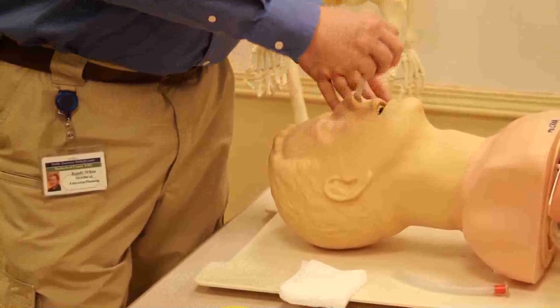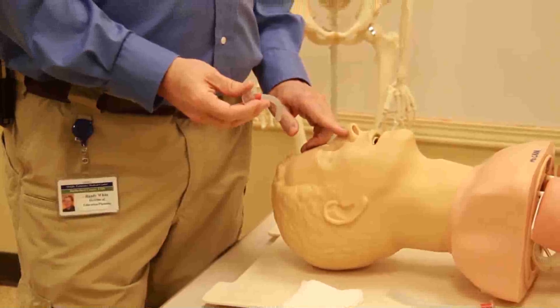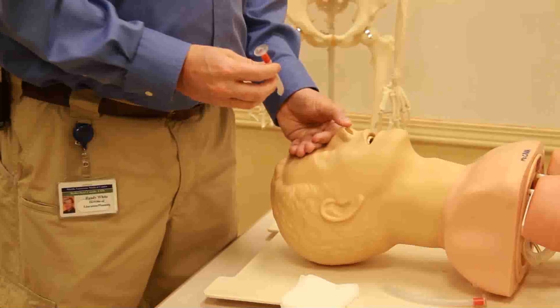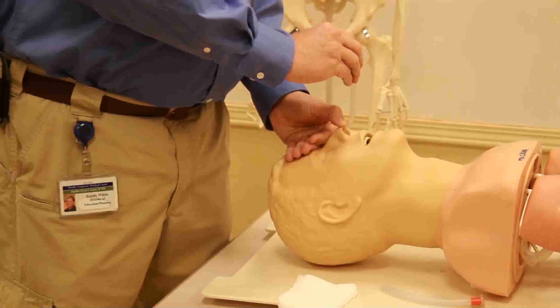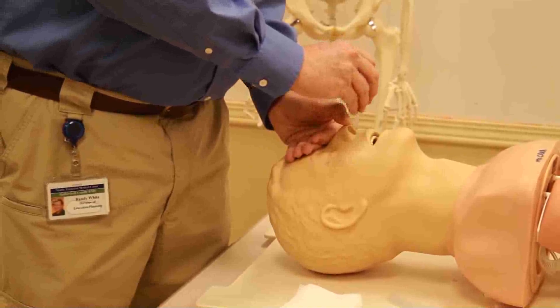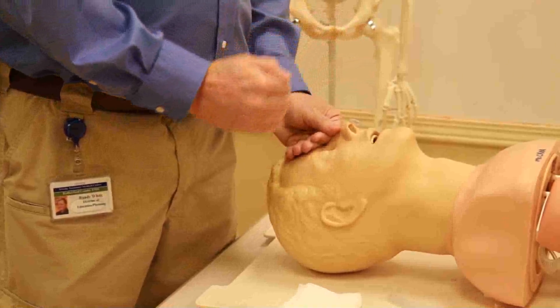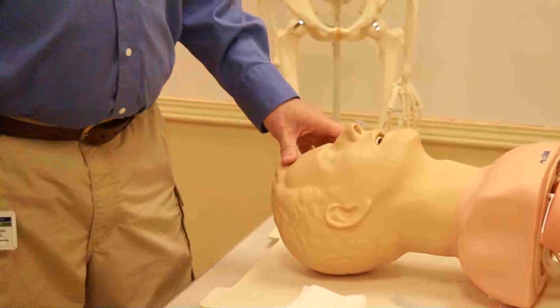If you don't have a straight shot or meet resistance on the right side, we want to insert on the left side. Again, pull the nose back, bevel toward the septum, and roll the airway down. After we get past the septum, we're going to turn the airway 180 degrees and go straight down toward the curvature of the throat. Again, we'll be able to ventilate and oxygenate, or do whatever we need to do for the patient.